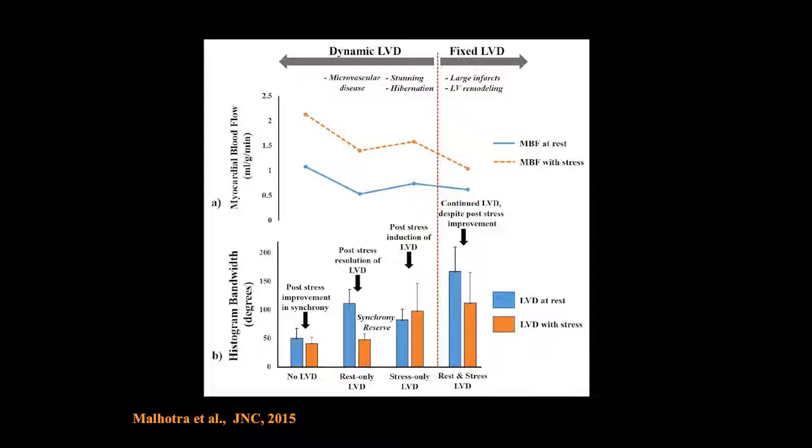Now, the premise was that when you do vasodilator stress, there can be improvement in ejection fraction because of recruitment of myofibers. The vasodilation results in recruitment of myofibers, something which we refer to as the Gregg phenomenon. The recruitment of myofibers results in improvement in LV function, and the PET people will actually say that if the EF does not improve on stress imaging, that signifies ischemia, even though your perfusion might look normal, or might signify microvessel disease.